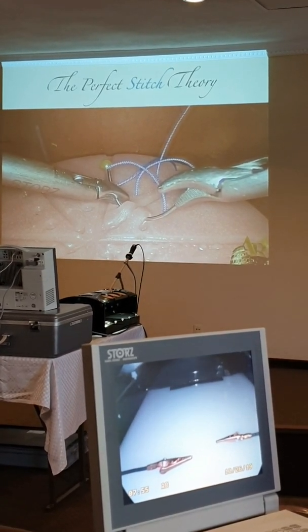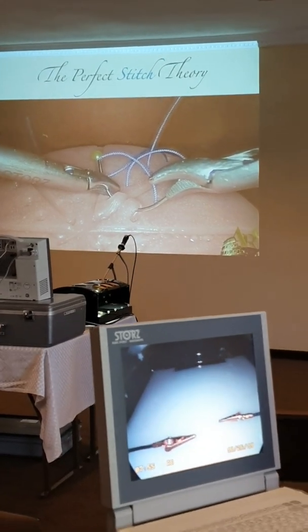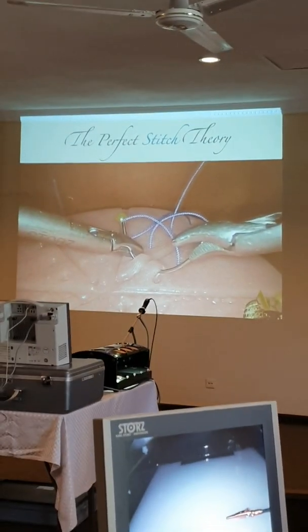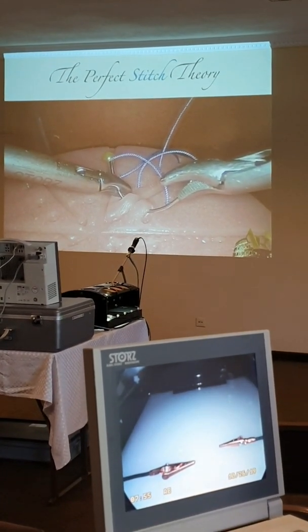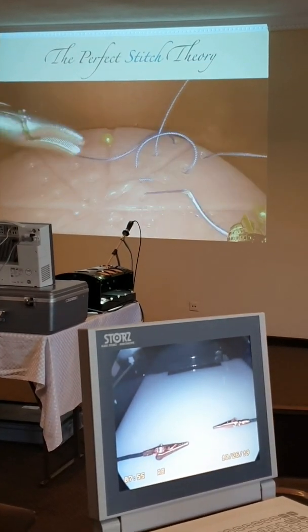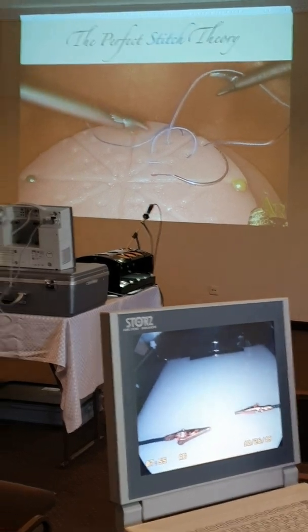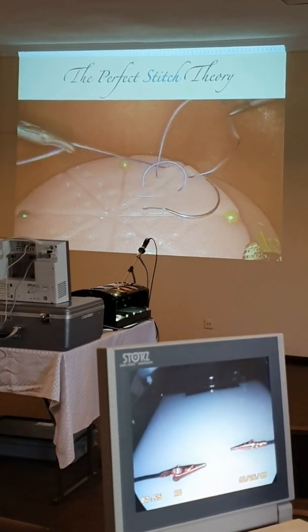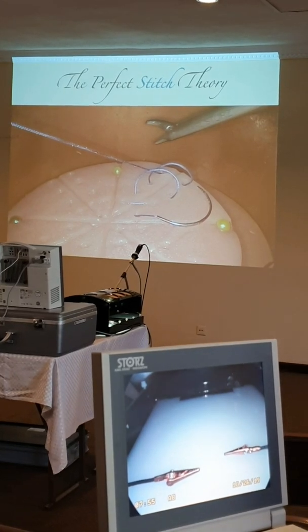Look at the position. Can you imagine a way that he would organize the needle in his needle holder to perform with his right hand, since his right hand is dominant? So it's impossible. You have to master yourselves how to do it with both hands, and it's completely feasible to do a suturing like this.